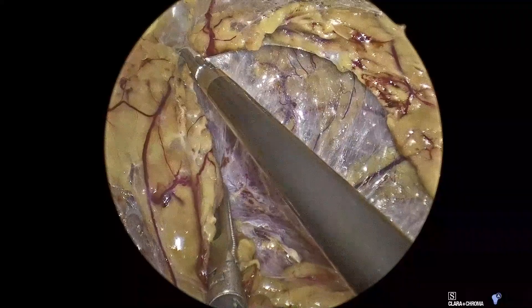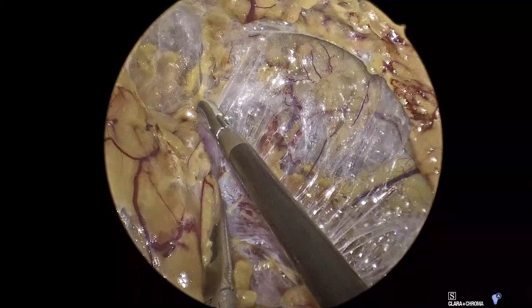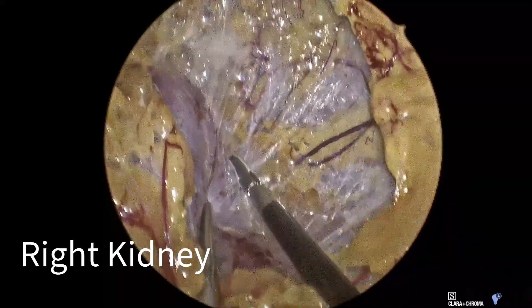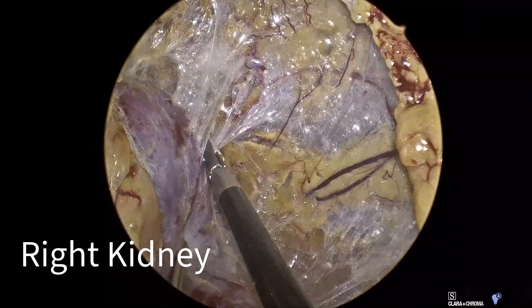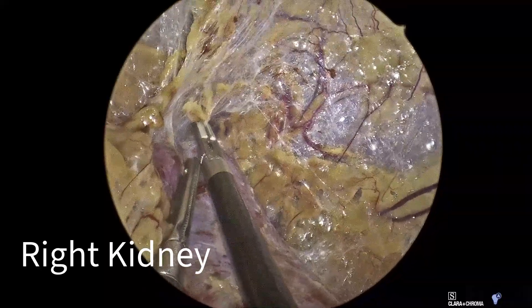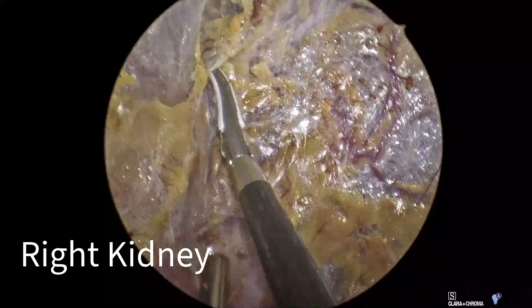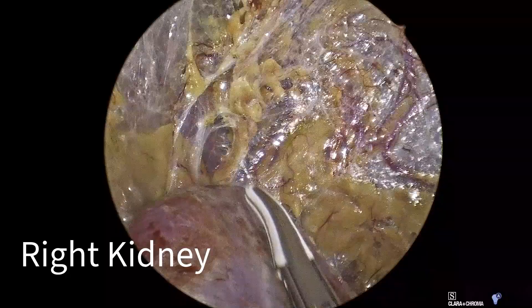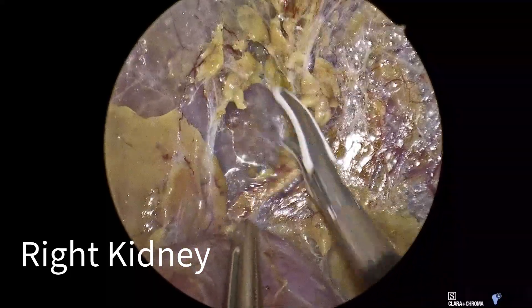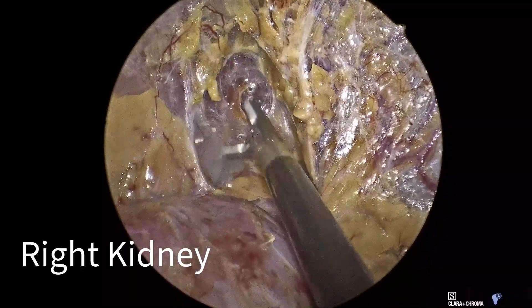A fair amount of the operation starting out is mobilizing the right kidney, which I'm retracting with my grasper. At the beginning of the operation, I've placed a 12 millimeter incision just below the tip of the 12th rib, and then blunt dissection creates the retroperitoneal working space. Two additional five millimeter ports are placed under direct visualization forming a triangular configuration for the endoscope and instruments. A five millimeter endoscope is inserted and carbon dioxide insufflation maintains a pressure of 28 millimeter mercury to expand the retroperitoneal space. I first identify key landmarks, including the paraspinous muscle and the right kidney.